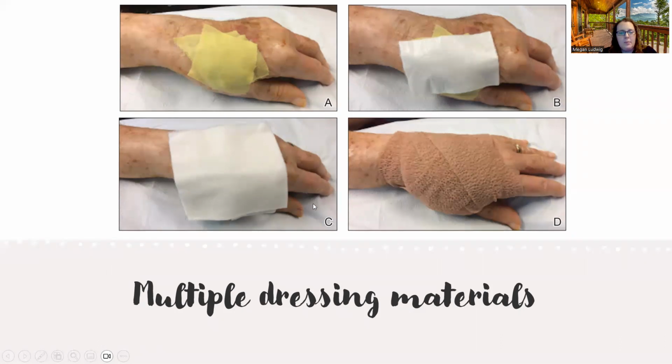How does it stay in place? You can put tape completely around it, tape their entire hand up. But this patient, in my opinion, the reason why they probably did it this way, not just for comfort, is that this patient looks to be a little bit older. Their skin is thinner, and frequently taking tape on and off can damage their skin very easily because it's so thin. When they bleed, then they have all these other issues. So you don't want to do that.